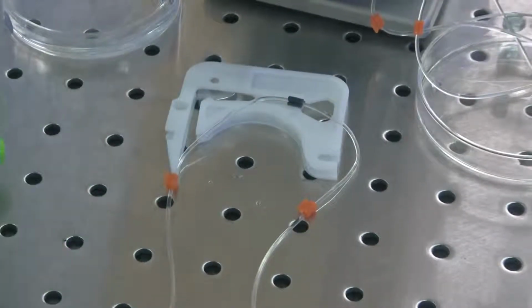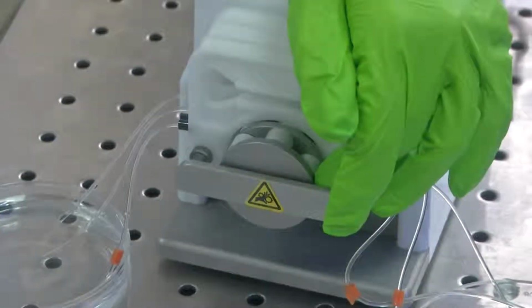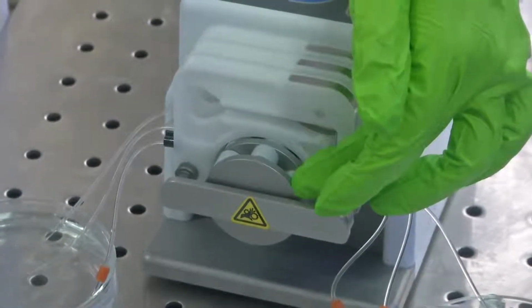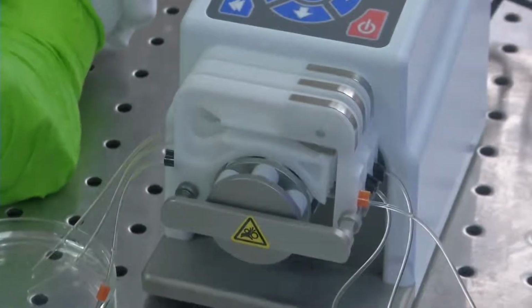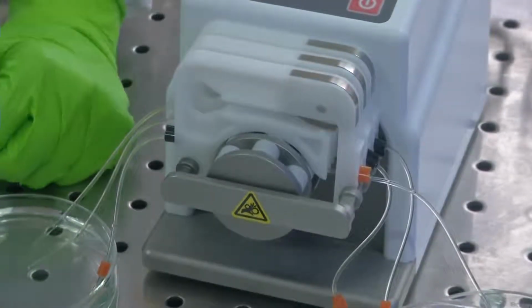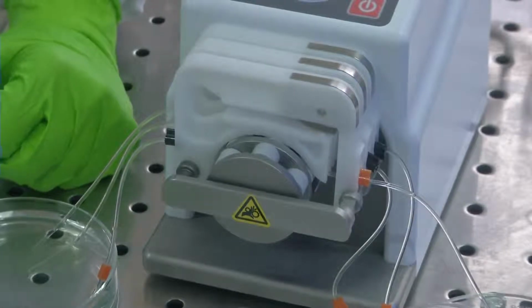Now let us see, can you point out the rollers? As Suman is pointing out, we have the rollers. There are 6 rollers which trigger the entire pumping mechanism. So it pumps the fluid through these silicon tubes.